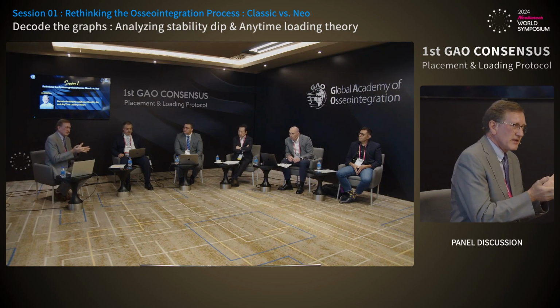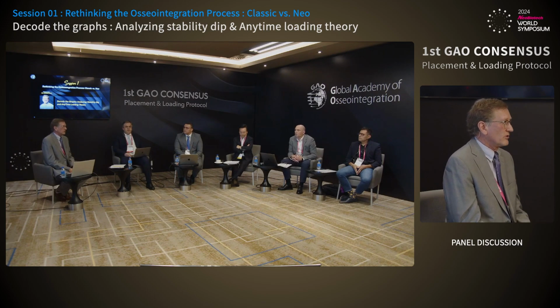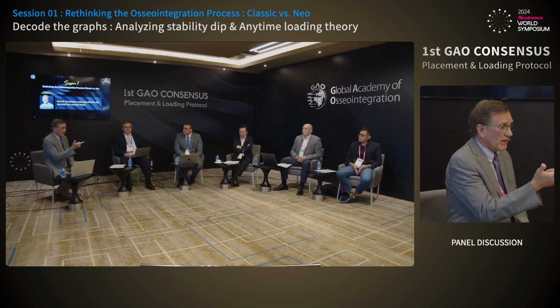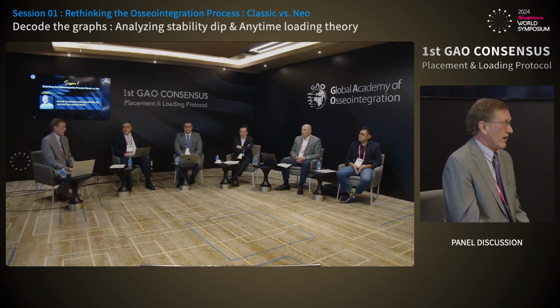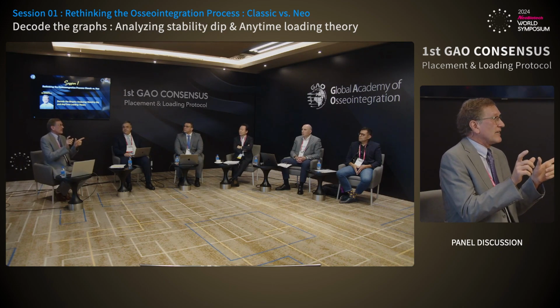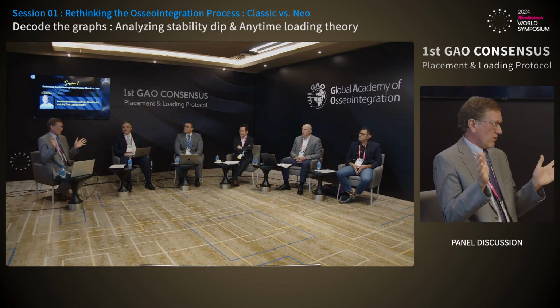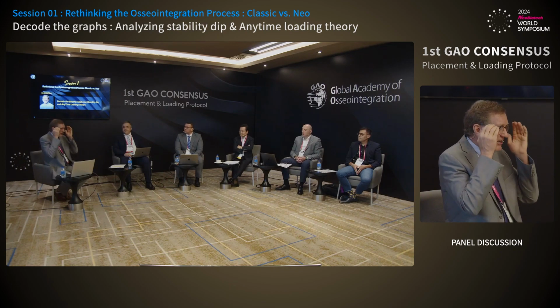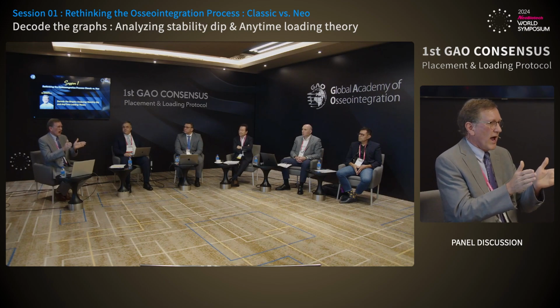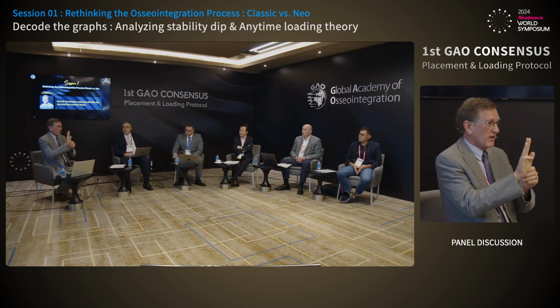So instead, what I'm saying is that if we have good healed bone, then that bone will be strong enough to support an immediate, an early, and a conventional loading. The grafts themselves show that instability area, the no-load zone. And we've all learned that. We all know that. Being able to change our mindset to say, is this a scenario where I could potentially load during the immediate, the early, or the conventional?